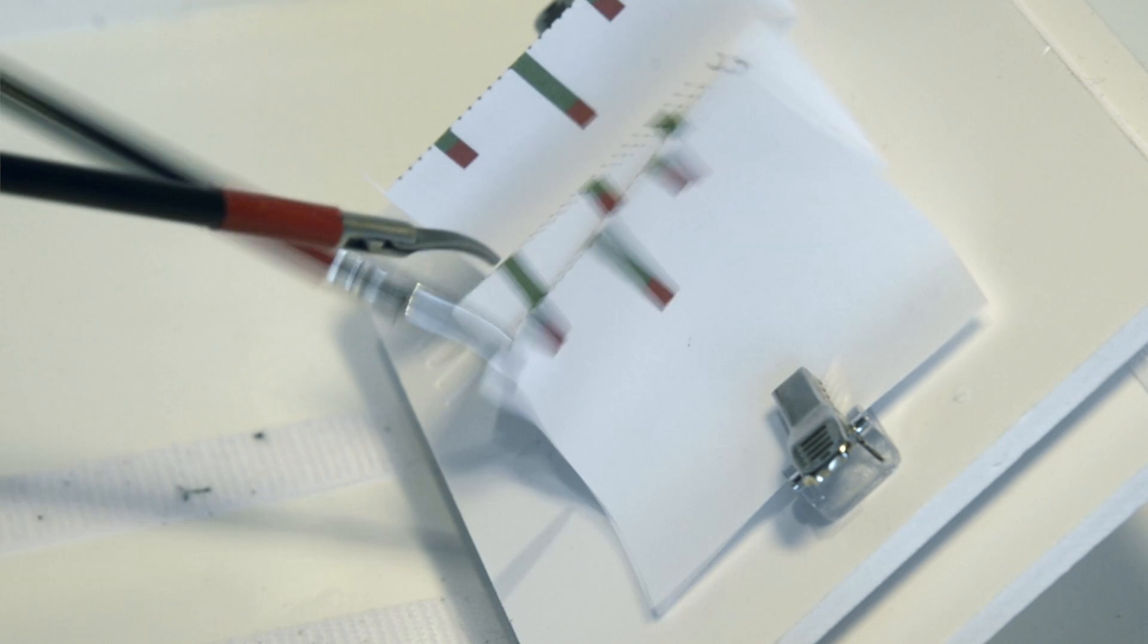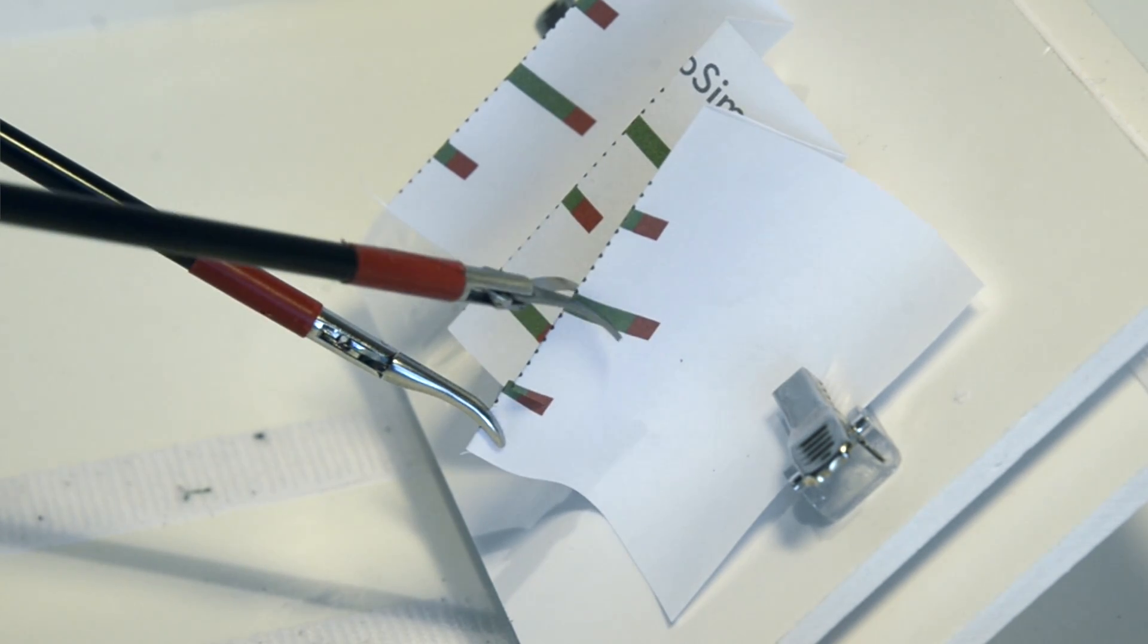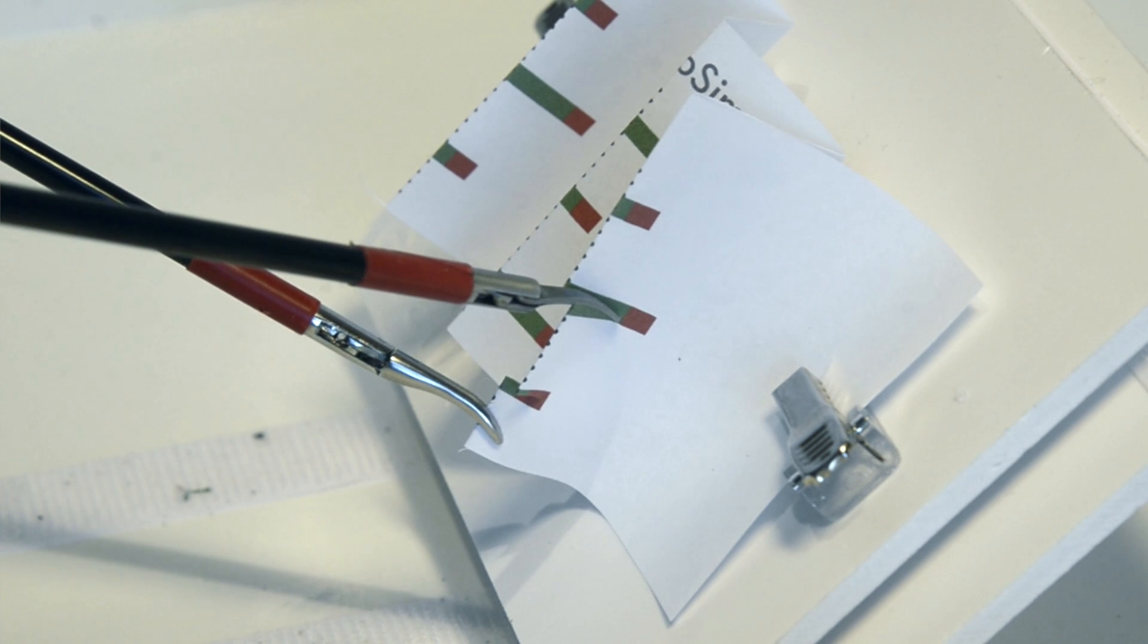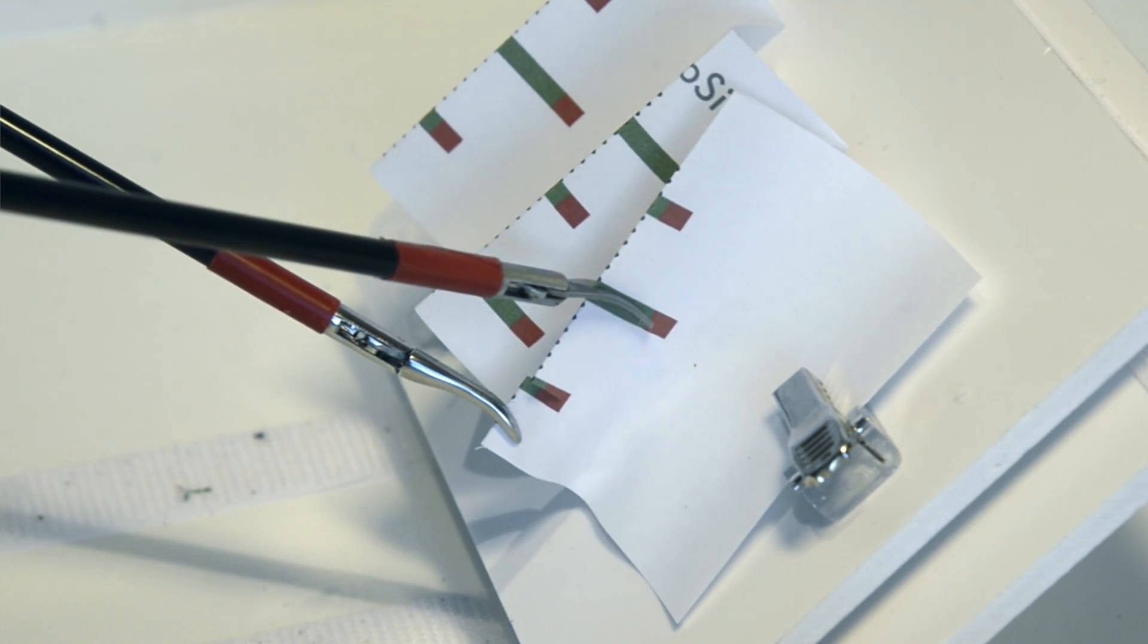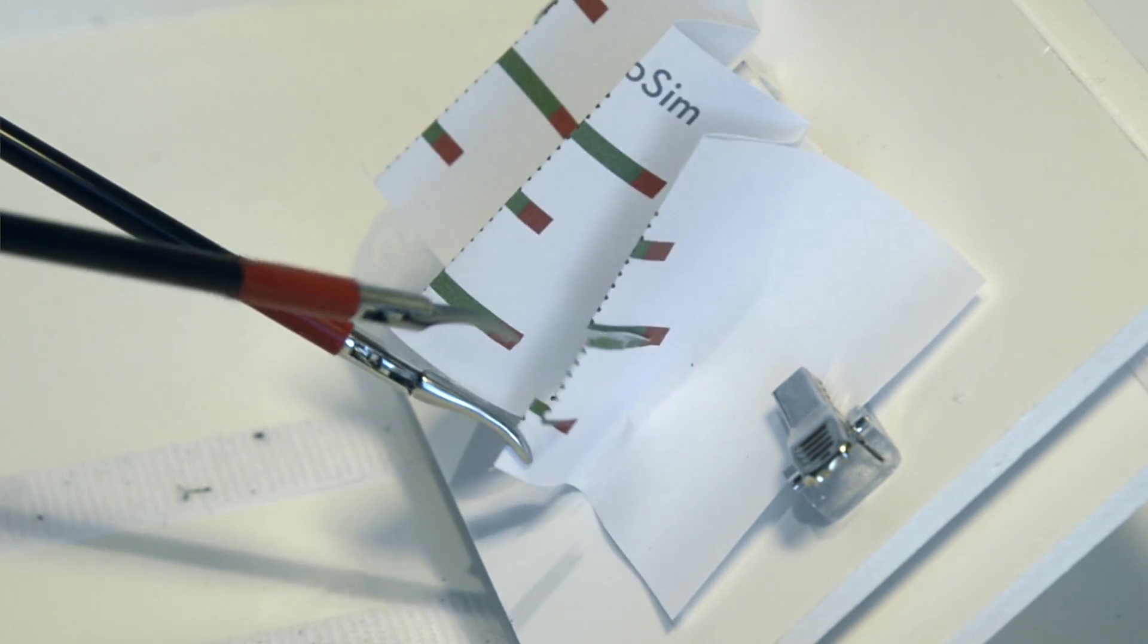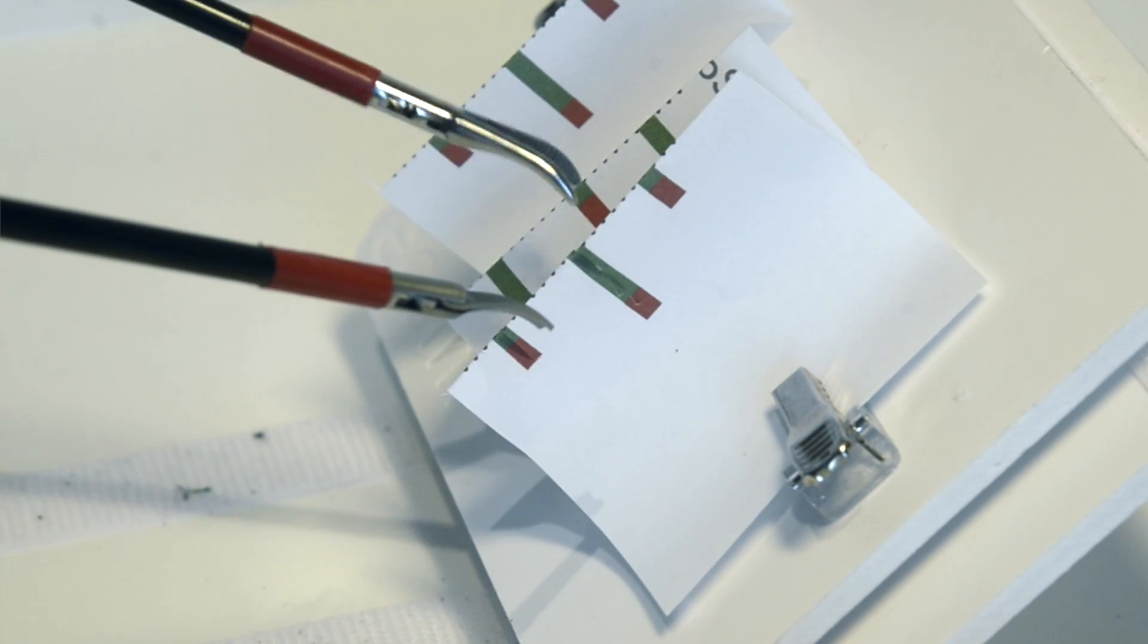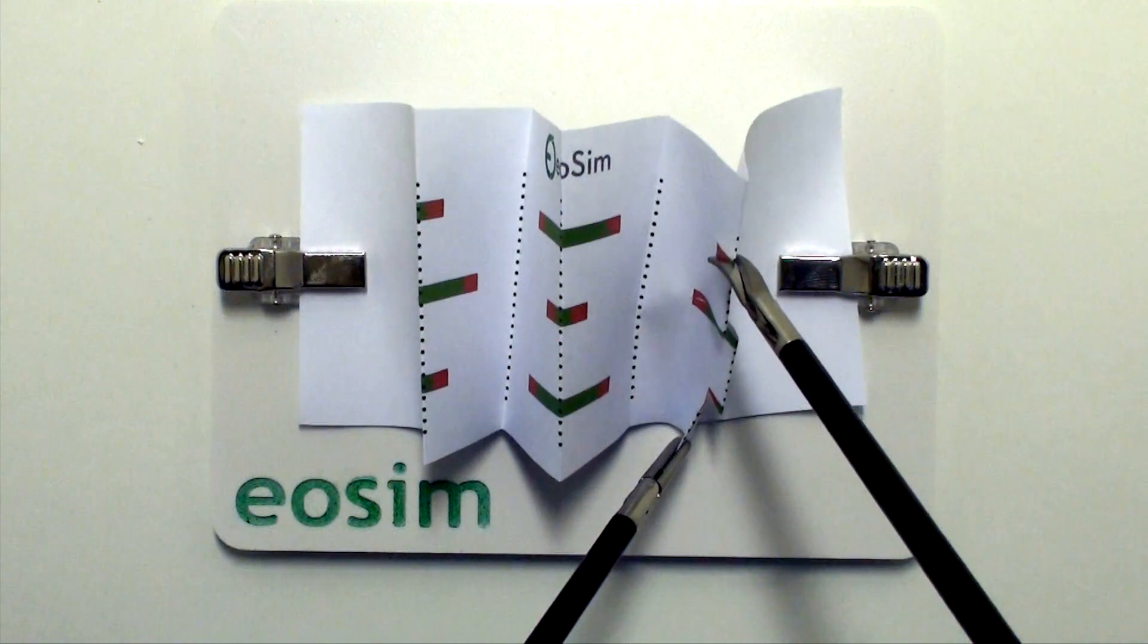For every single time you manage to cut down to the red, you gain a mark. However, if you miss the red, or if you don't go far enough, or if you overcut, then you do not receive a point.